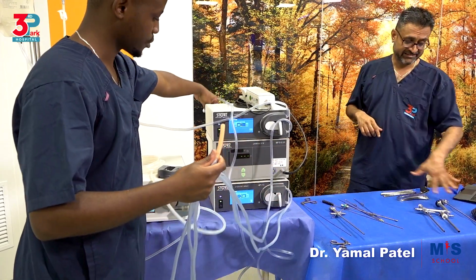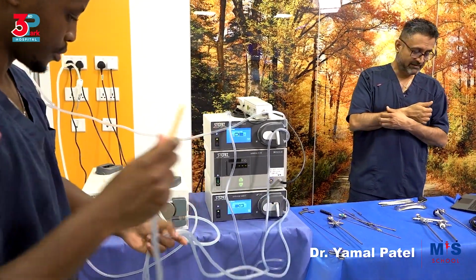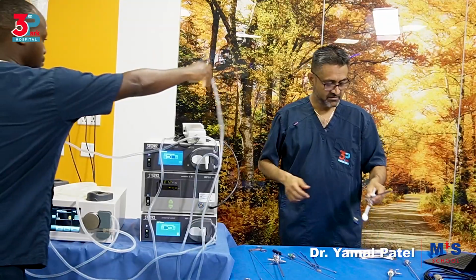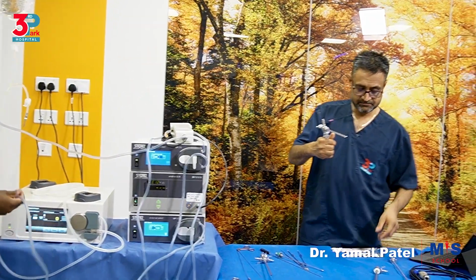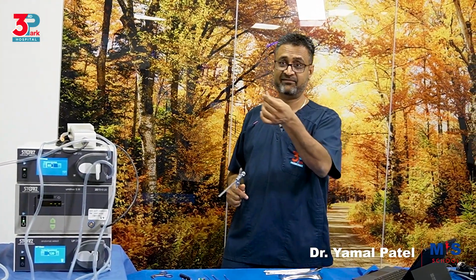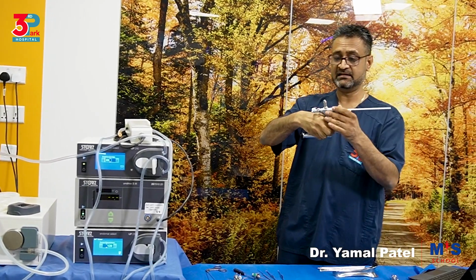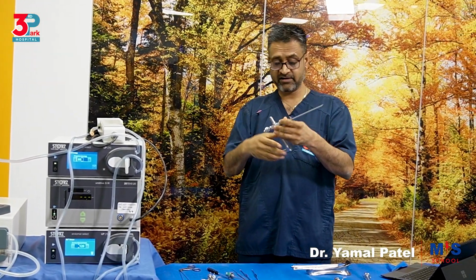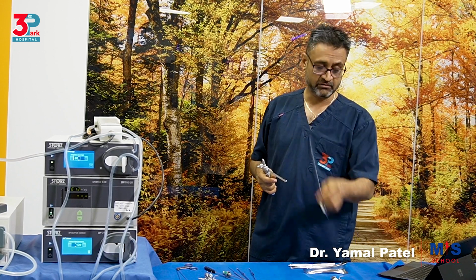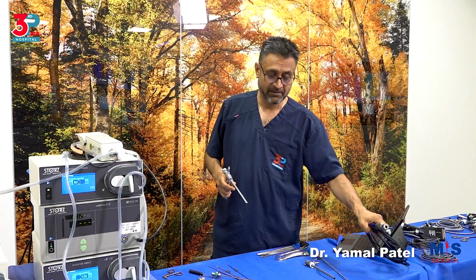We are going to set up and show you how we will assemble this. So in this we have the inner sheath, an outer sheath, the telescope is already integrated, and we have the actual blade or the shaver blade and the cable.